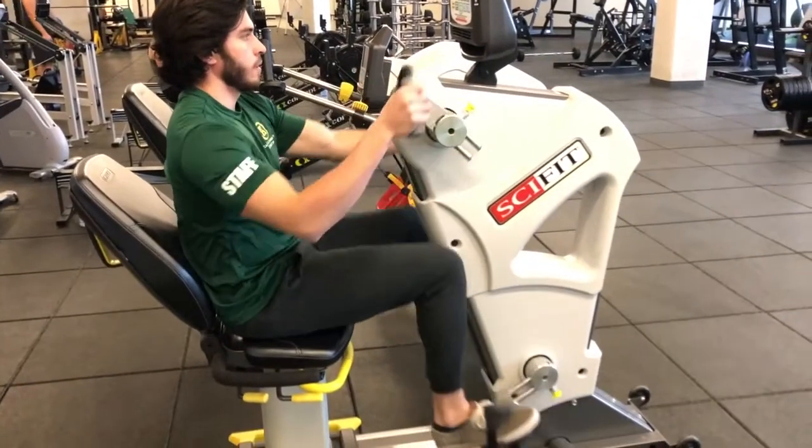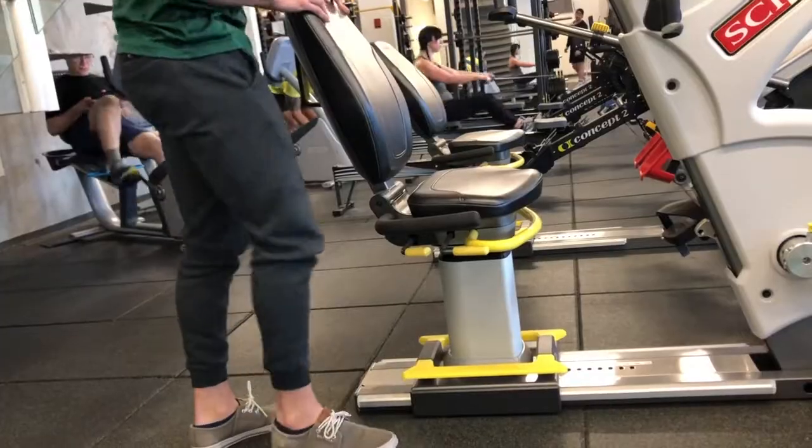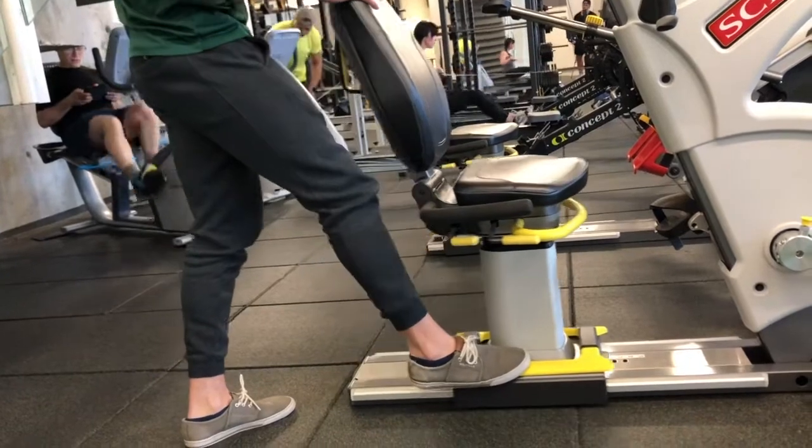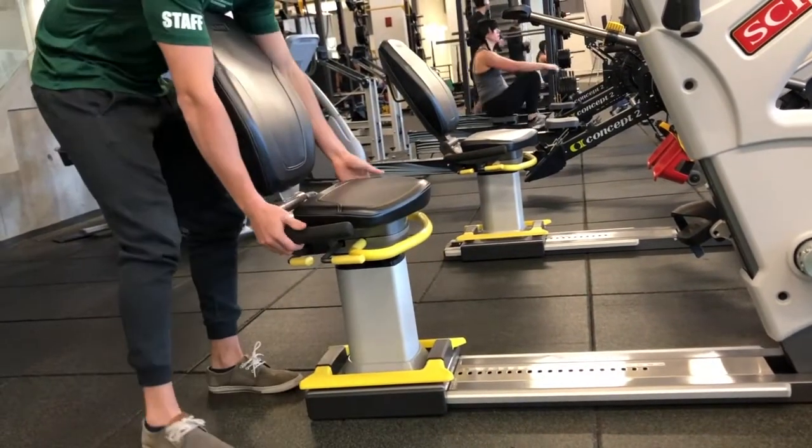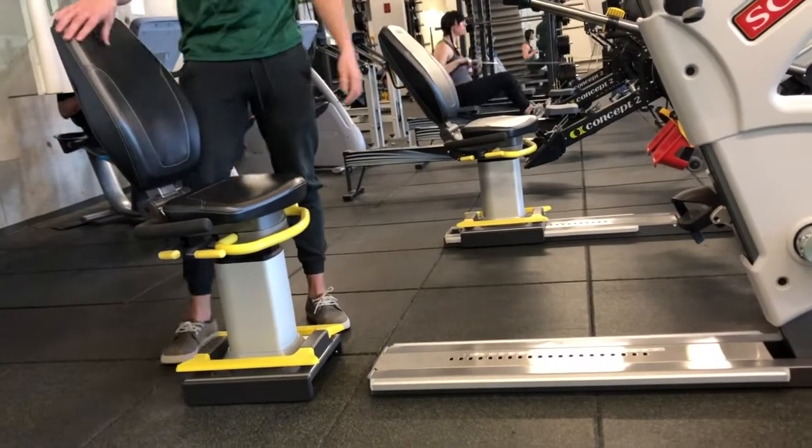Here's how to set up the Sci-Fit Pro 2 Total Body Exercise Bike. Range of motion can be adjusted by pushing down the yellow pedal to slide the seat back and forth, or it can be removed to allow for wheelchair access.